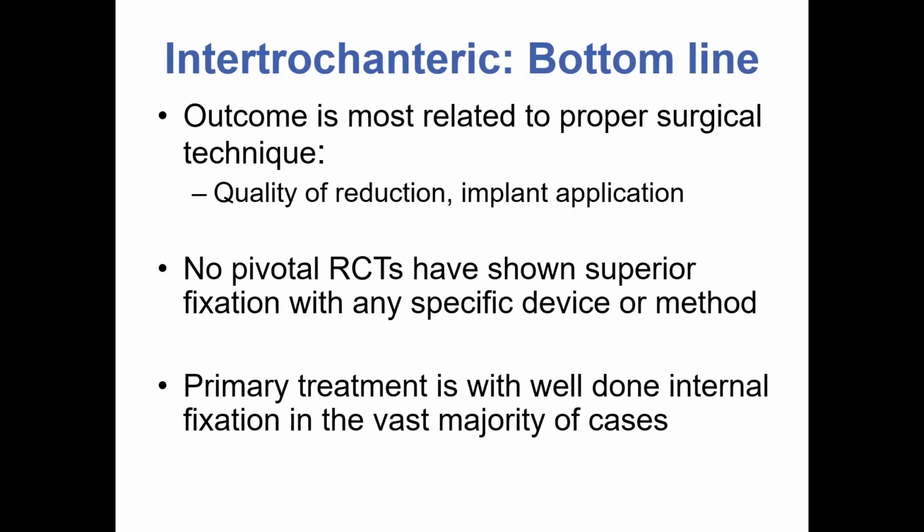So the bottom line for intertrochanteric fractures is that outcome is most related to proper surgical technique, specifically the quality of reduction and implant application. No pivotal RCTs have shown superior fixation with any specific device or method. Primary treatment is with well-done internal fixation in the vast majority of cases.